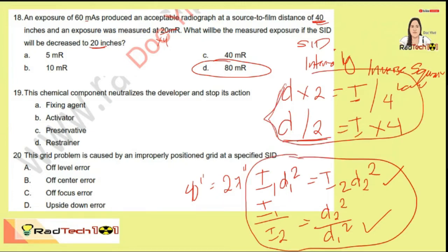Okay? Sige. So next, this chemical component neutralizes the developer and stops its action. So this is the activator which can be found sa fixer. The purpose of the activator is to neutralize the developer and stop its action, kasi tapos na si developer, need na siyang i-fix. Yung fixing agent natin is the ammonium thiosulfate which removes the undeveloped silver bromide. The preservative, pareho lang na sodium sulfite both sa developer and sa fixer. Yung purpose ng ating sodium sulfite as a preservative is to maintain the chemical balance.